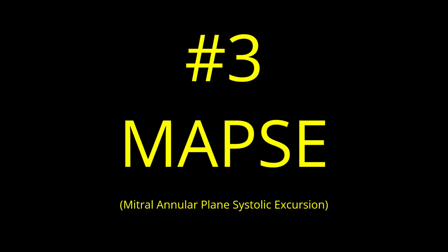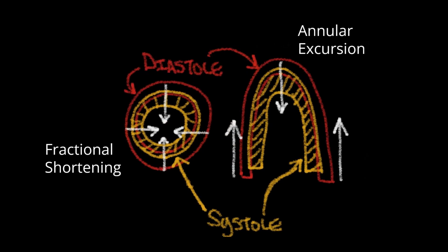Our third and final measurement for ejection fraction is going to be MAPSE, which stands for mitral annular plane systolic excursion. This is similar to TAPSE, which stands for tricuspid annular plane systolic excursion, which is used to measure RV function. MAPSE is going to look at the mitral annulus to measure LV function. So the measurement for MAPSE is a little bit different. When we look at fractional shortening, we're measuring the change in the chamber size in these dimensions as seen in the white arrows. But for MAPSE, we're going to be looking at the rise of the base of the heart, or the annular excursion.